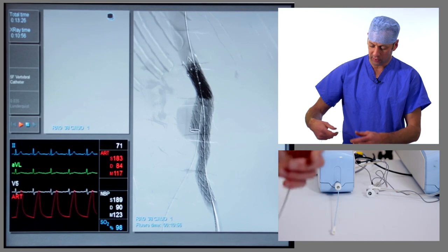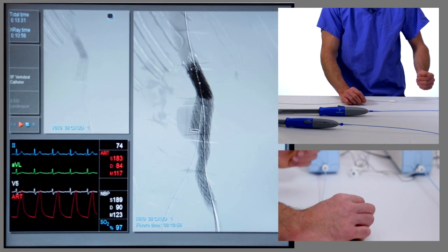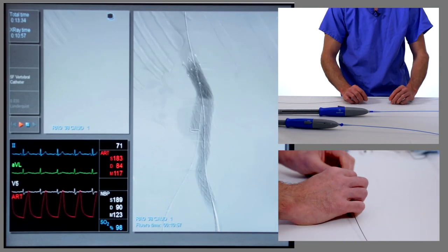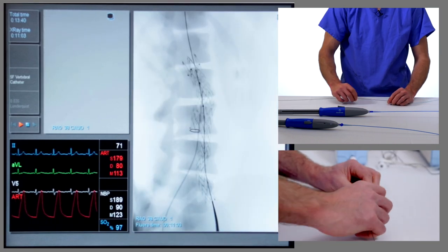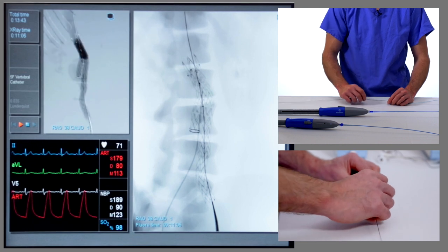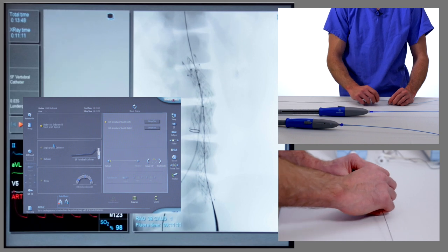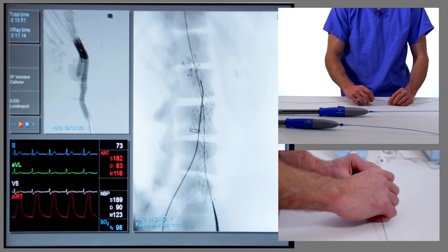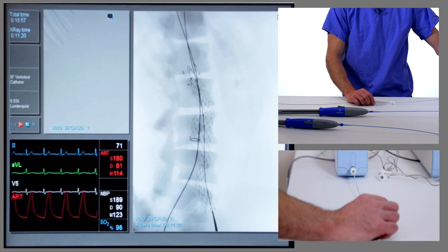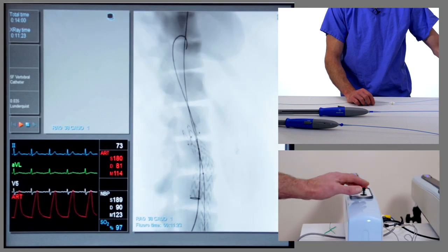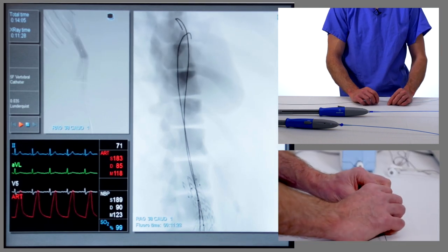We now need to introduce another stiff guide wire to allow us to insert the contralateral limb delivery system, so we'll use another Lunderquist wire. At this stage, you need to be very careful as you take the stiff wire up into the thoracic aorta. If you have any doubt, advance the catheter over a softer wire first and then exchange for the stiff wire. We'll screen towards the patient's head as we insert this up into the distal aortic arch — and that's far enough.